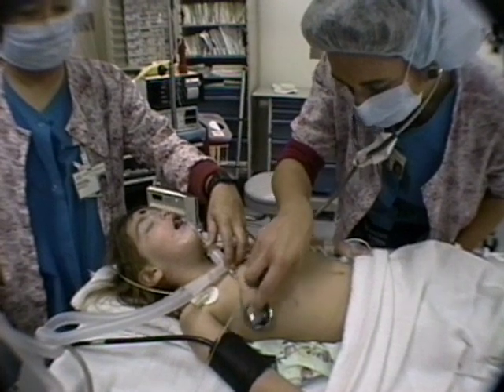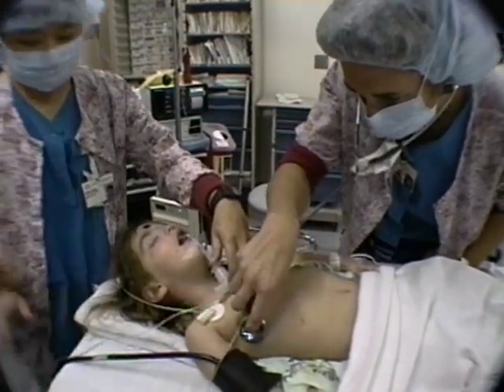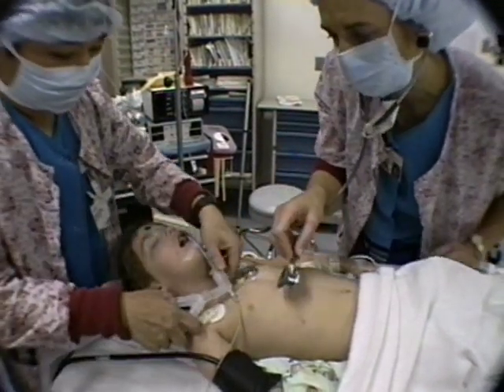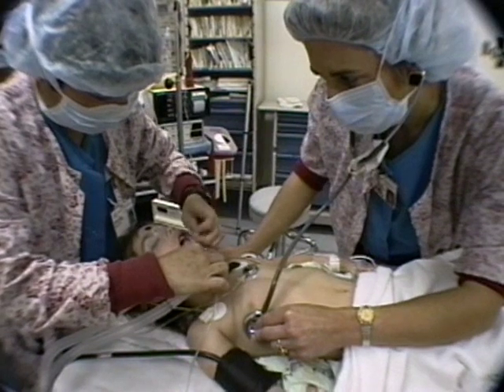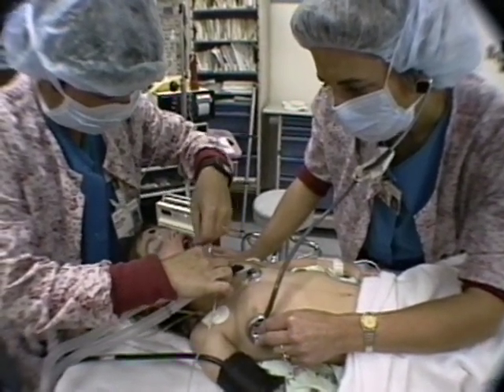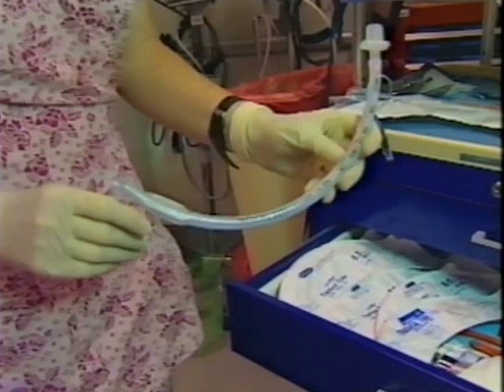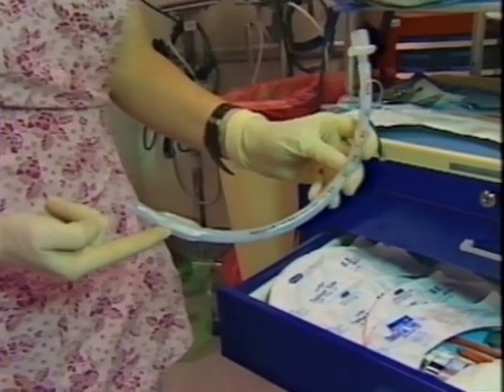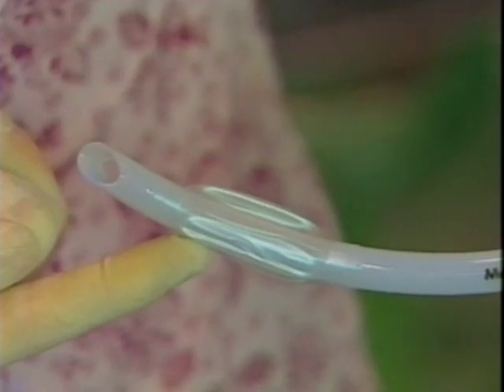Positive pressure ventilation depends on providing enough pressure to inflate the lungs. If there's a break in the pressure seal, such as through a leak back out through the glottis around the endotracheal tube, then ventilation may be inadequate, and the patient may potentially aspirate around the tube. We use cuffed endotracheal tubes to provide the seal in adults, but not usually in infants and small children because their larynxes are anatomically different.